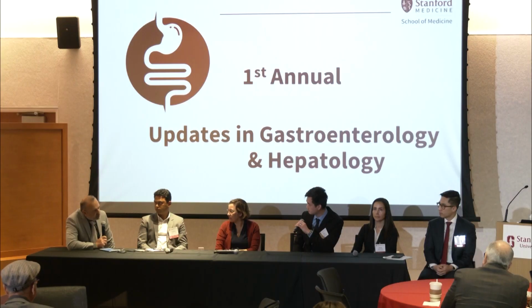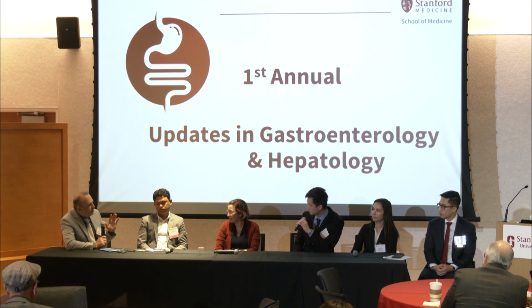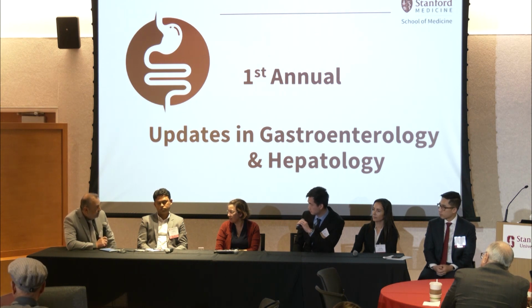And so when you're saying tortuous colon, you mean that there is a sharp angulation, there's a fixed sigmoid, right, compared to the looping of the colon. Exactly. Yeah, where there's a fixed colon with a lot of angulation. I don't actually think the rigidizing overtube is great in these particular cases. One, because you've suddenly increased the diameter of the tubes that are actually going into the colon.